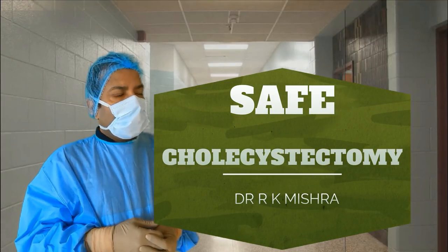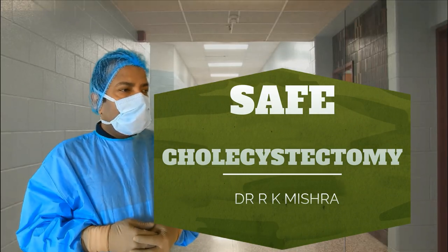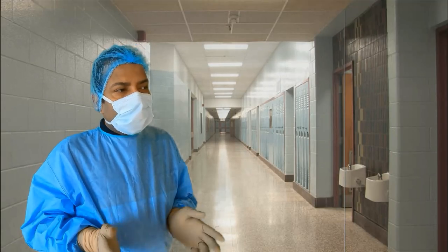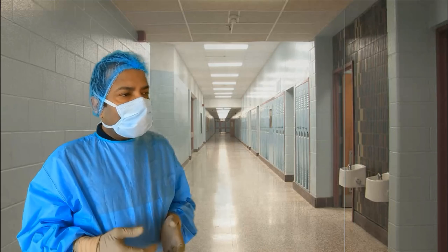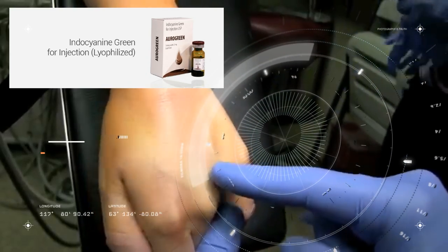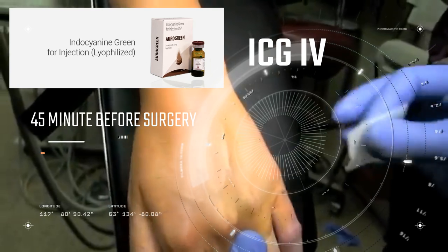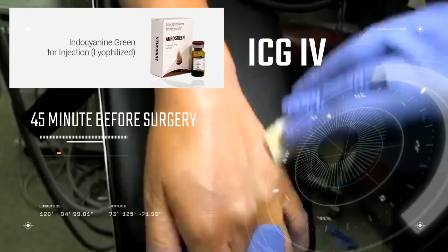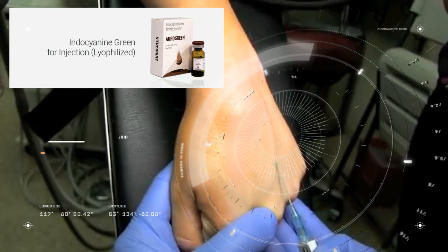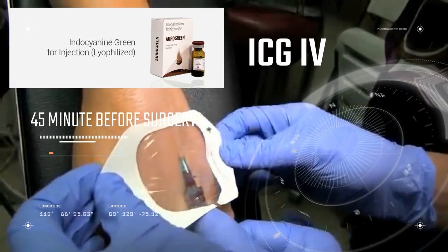Today we are going to discuss the safe way of performing laparoscopic cholecystectomy. One of the safe ways is to use cholangiography, which you can perform with ICG. You will take 1 mg ICG in 1 ml and inject it IV 45 minutes before the surgery. This patient has cholelithiasis with cholecystitis and we are injecting the ICG intravenously 45 minutes before the procedure.